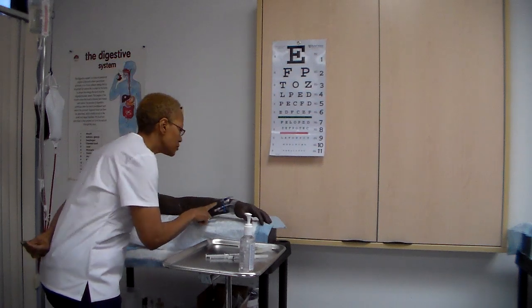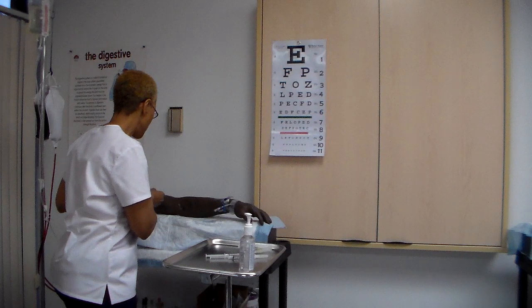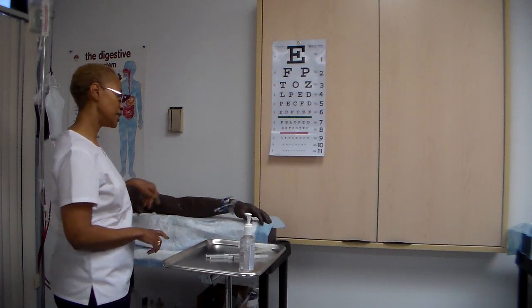Assess client's status after giving medication to evaluate the effectiveness of the medication. Okay. So I'm going to look at my client. I'm going to look at his site, make sure it's not red, it's not swollen, it's not cool, it's not complaining of pain. Okay. Ask client to explain medication's purpose and side effects. Okay, now what did I tell you this medication was for? Exactly. Record medication, dose, time, route, and time of administration.